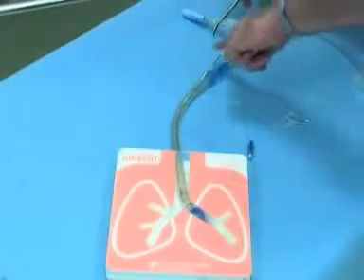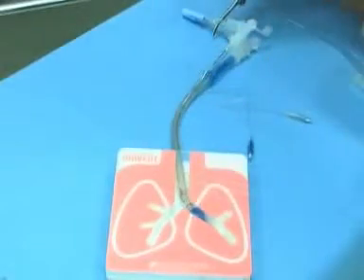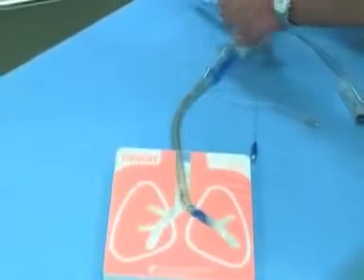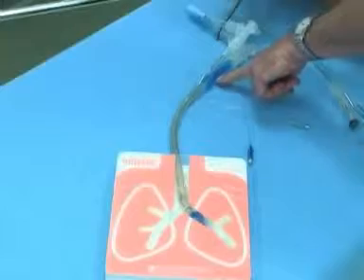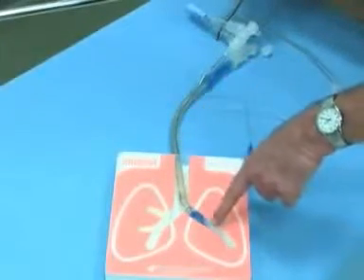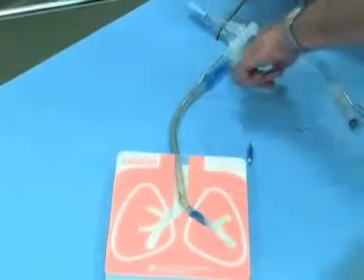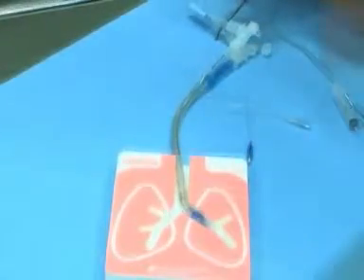You can put a fiber optic down here and take a look — we'll do more on that later. If we're going to isolate the left lung, we would clamp off here, open here, and that would allow you to empty air out of the left side of the lung and also allow you to put a fiber optic and look down the left.